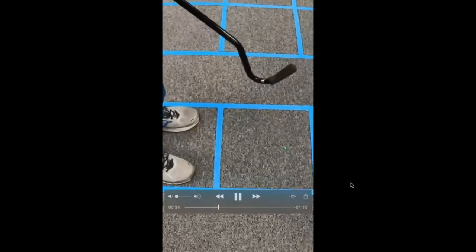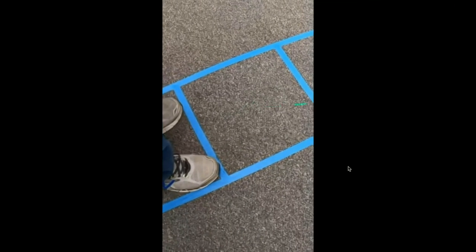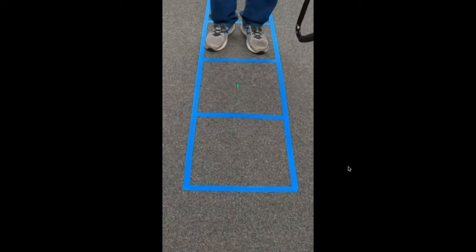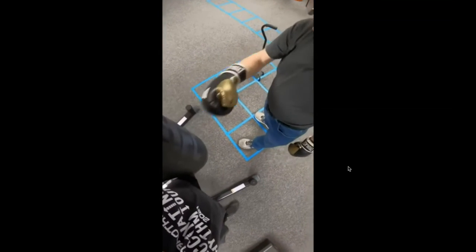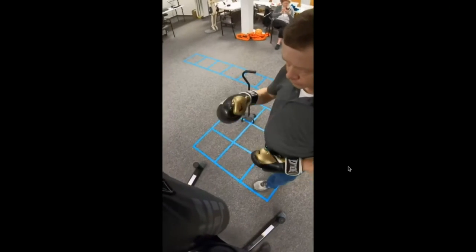But again, an external focus of attention. So instead of just trying to initiate, hey, can you put your foot in the box? The laser is going to go into the box. And then he's doing more of a dynamic movement with a jump to step on the laser as he goes through. I thought this was a great application for working on getting through that bradykinetic posture. And then muscle coordination obviously carries over to some functional activities.